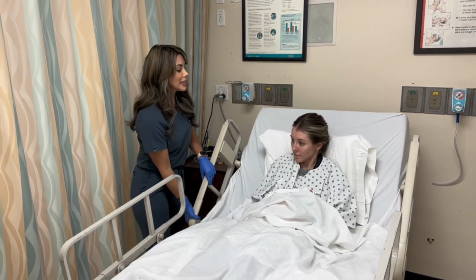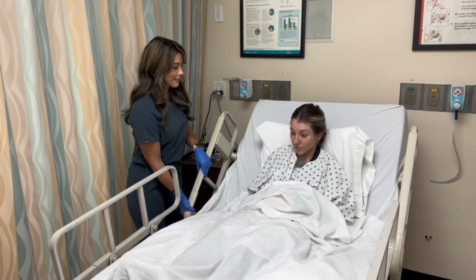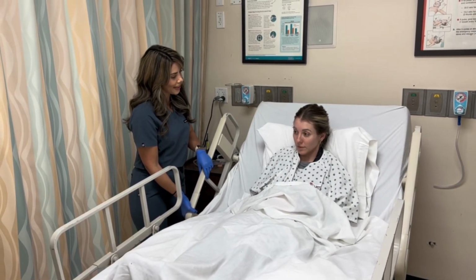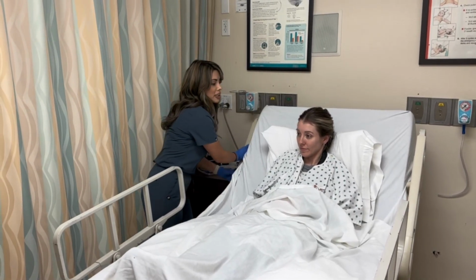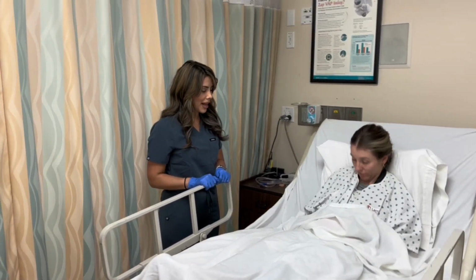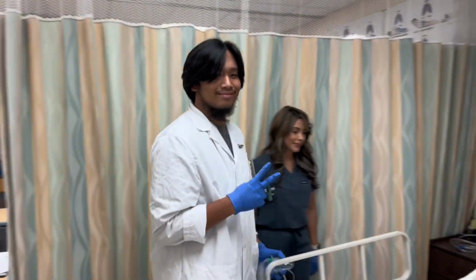I will go ahead and raise the bag. How are you doing today? I'm good. How are you? I'm doing good. And my assistant will go ahead and bring in the non-rebreathing mask.